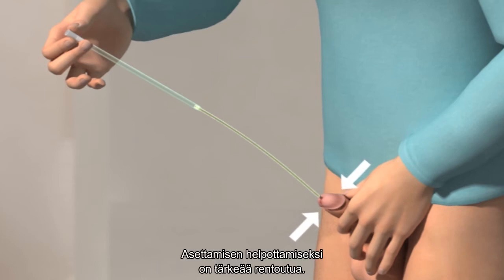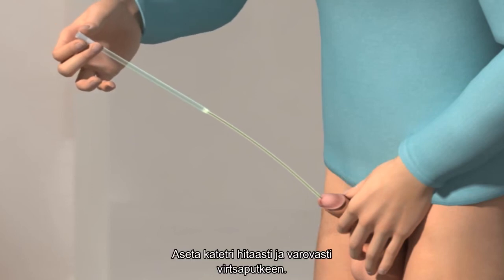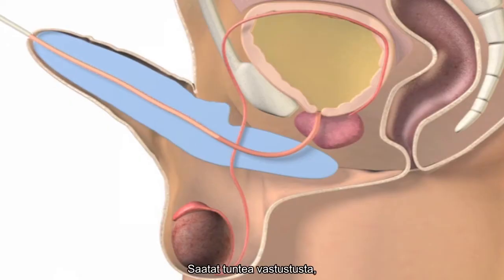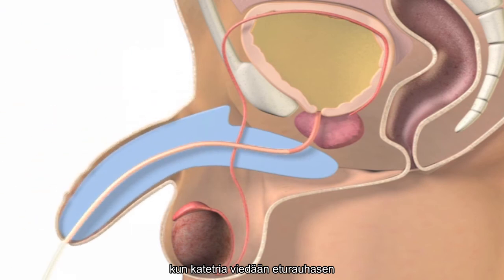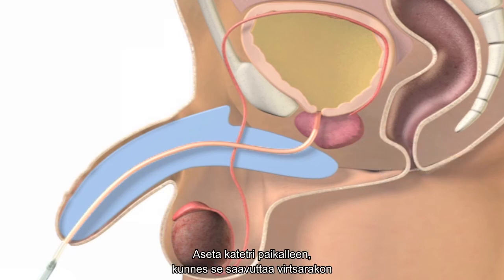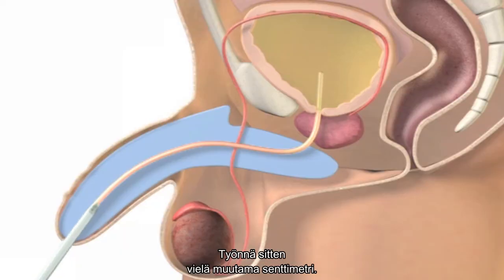To help insertion of the catheter, it is important that you relax. Slowly and gently insert the catheter into your urethra. You may feel some resistance when the catheter is passing the prostate and the sphincter, so be gentle. Insert the catheter until it reaches your bladder and the urine starts to flow. Then continue for a few centimeters further.